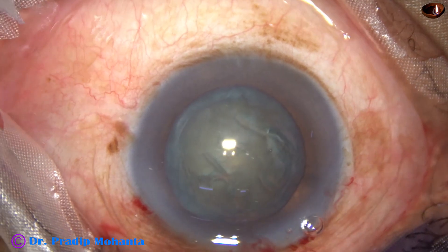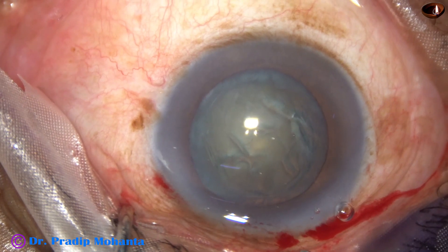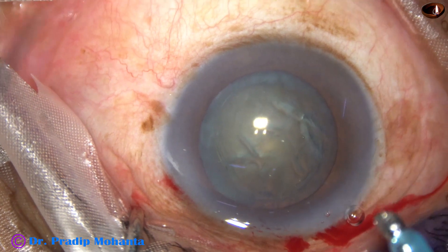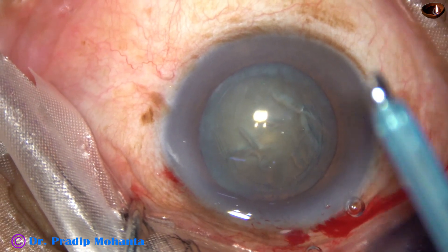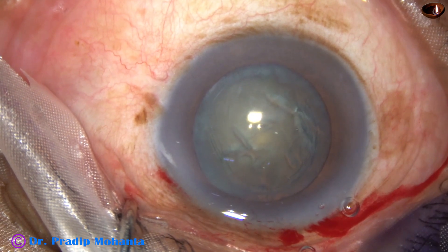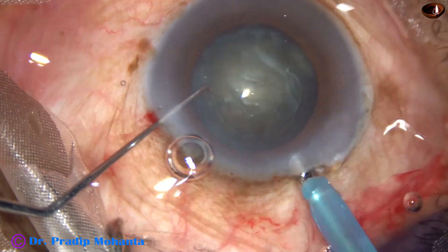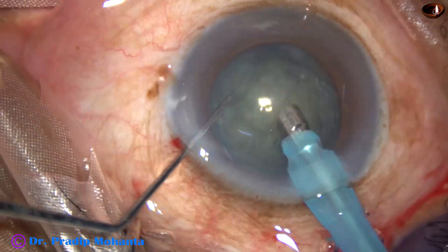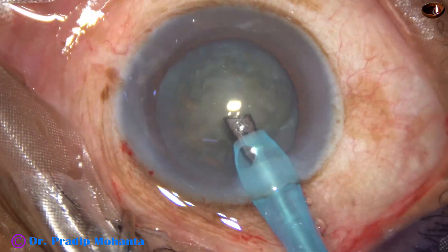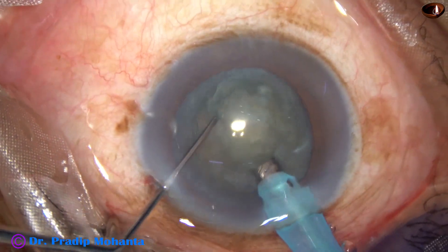Now is the time to introduce the phaco needle into the anterior chamber. The phaco tip 2.8 mm goes into the anterior chamber with its bevel down. Some superficial cortical lens matter is removed, and then this is direct chop.